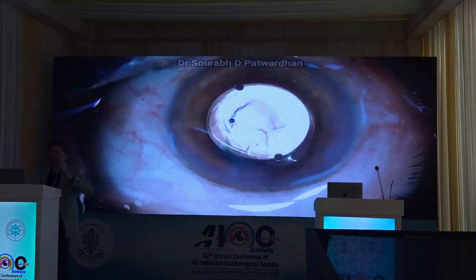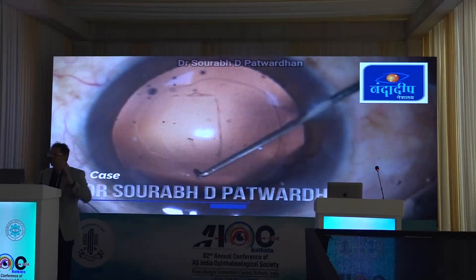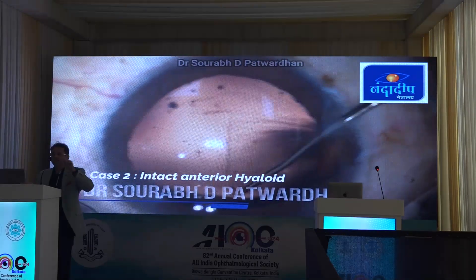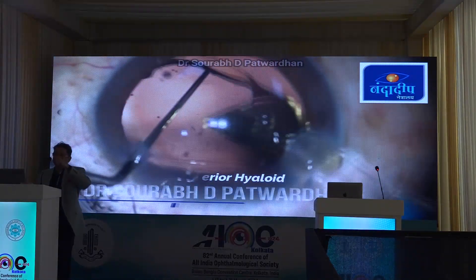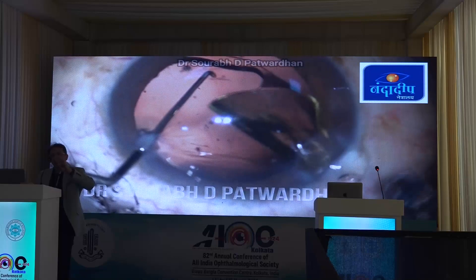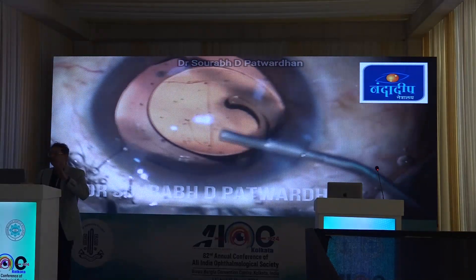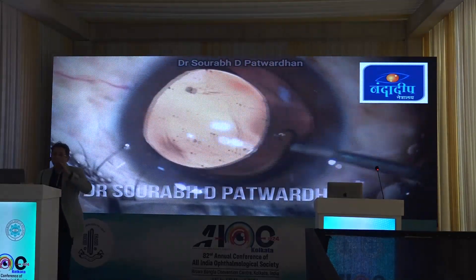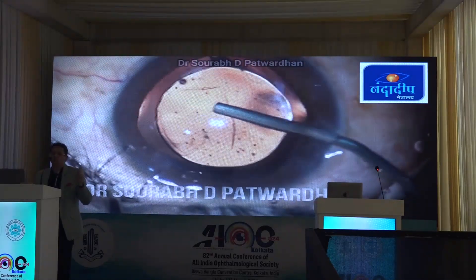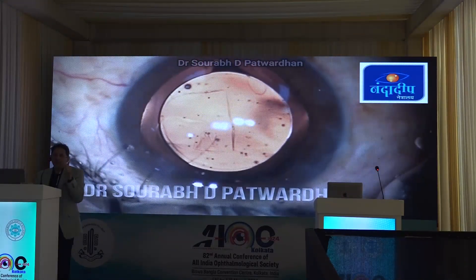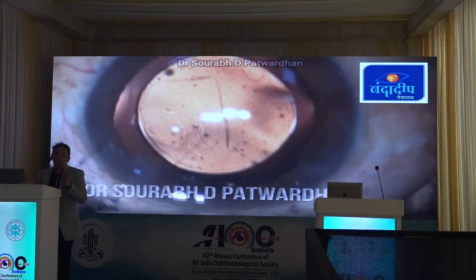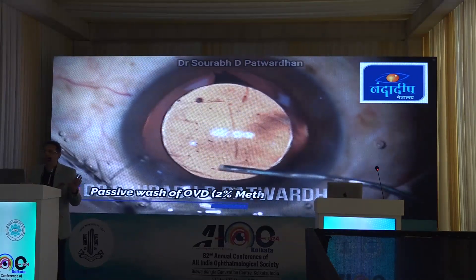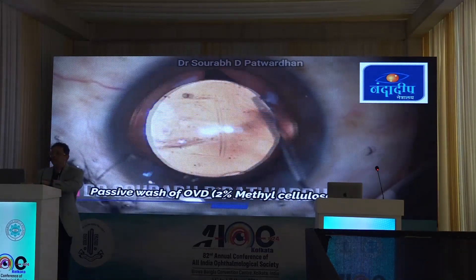If you are not confident converting a central PC tear into a CCC, no problem — if the anterior hyaloid is intact, gently place the IOL in the bag using the same maneuvers. Wash out the methylcellulose using just jets of BSS; it may take four or five minutes, but it works wonderfully well in these cases.